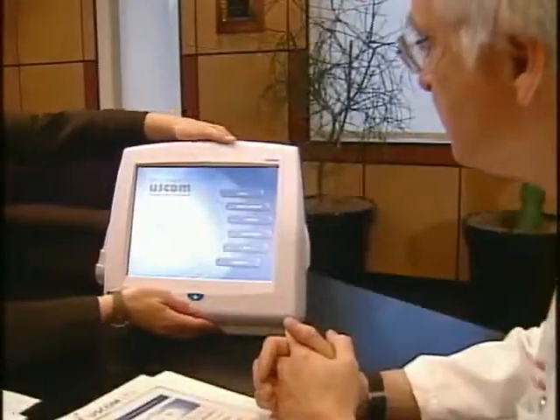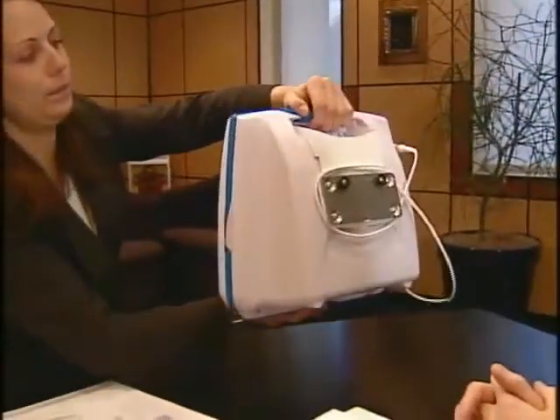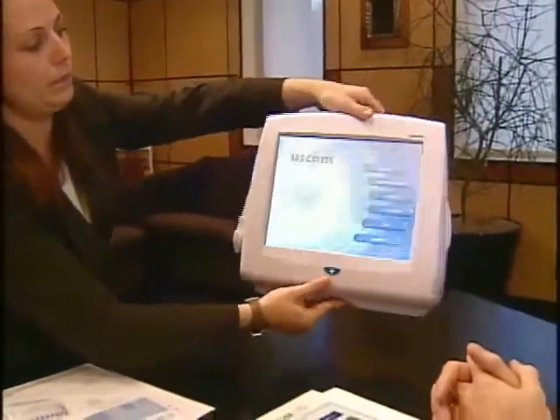So you're selling portability, is that what you're telling me? Right. It's entirely portable. What about your battery storage time? What's your battery storage time? The battery lasts 2 hours when it's fully charged, which is another nice feature, making it more portable and useful in rescue-type situations. So you have a teaching protocol for non-physicians as well as physicians?